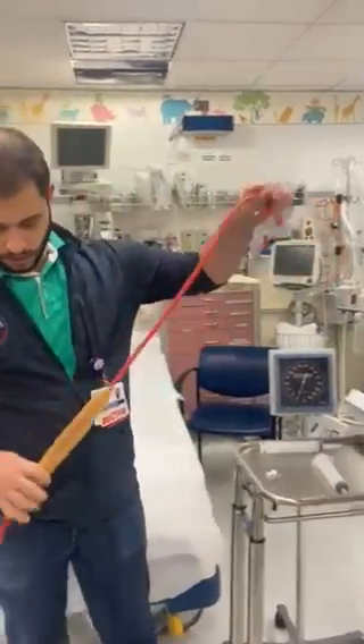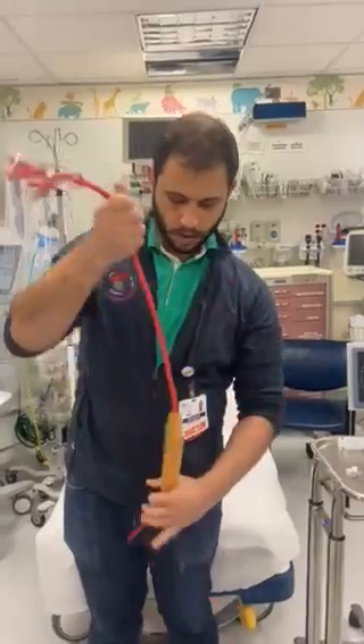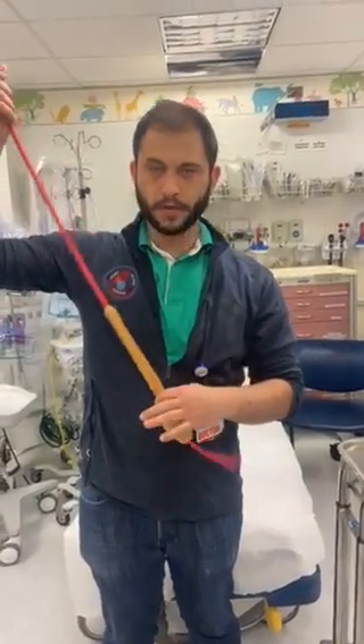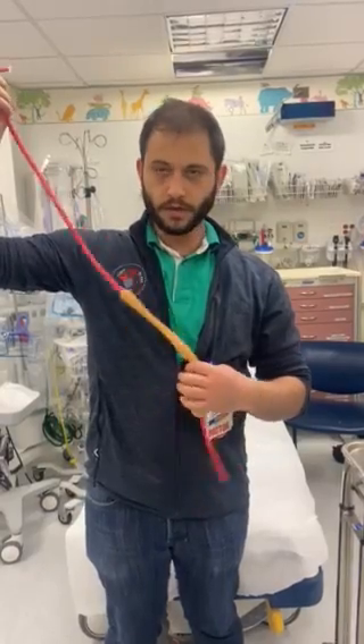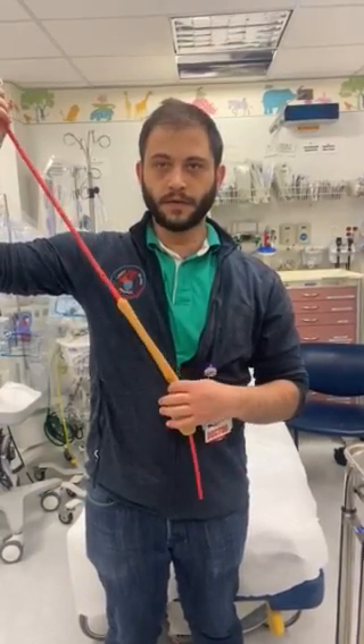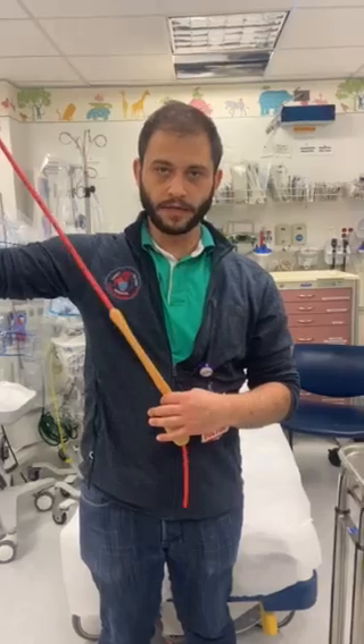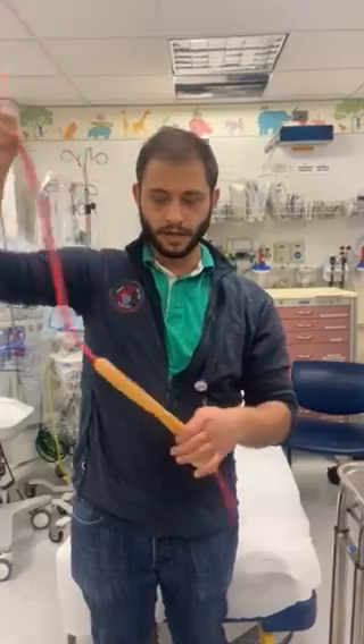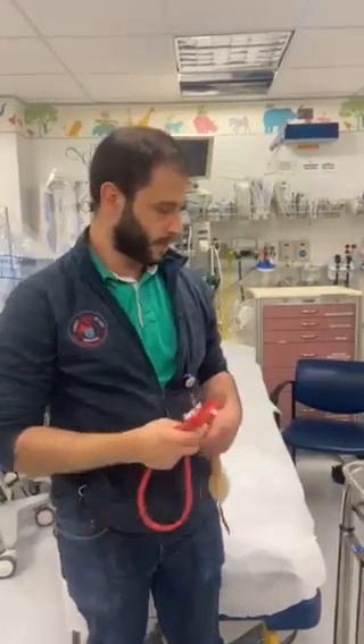At this point, we're going to already be at the point where the gastric balloon is in the stomach and inflated. So you've done the 50cc's, confirmed it's in the stomach with an x-ray, filled it up to 250, pulled traction, and the esophageal balloon is in place.